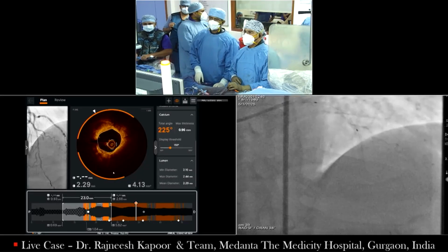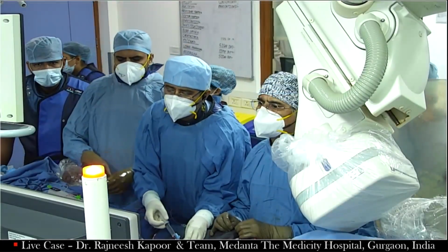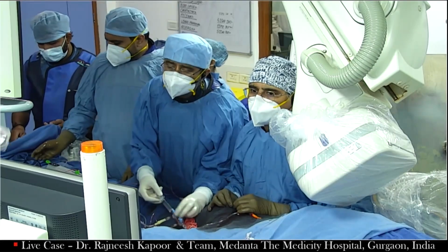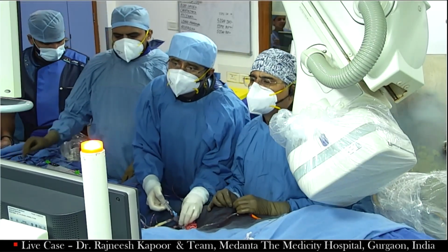10, 12, 16 down. We're back with you, Rajneesh. Yeah, so I'm just at a crucial step of catching the ostium of the LED, and I'll tell you what we have done.